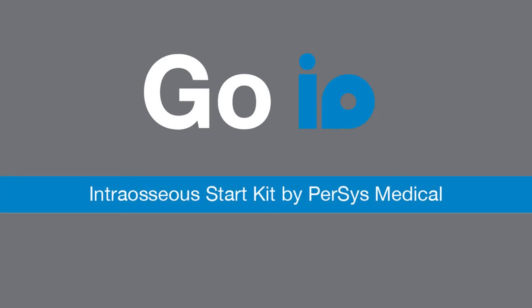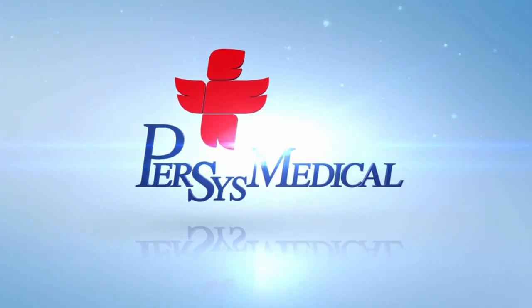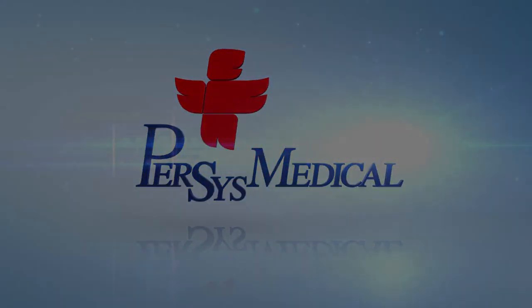Go I.O. Intra-Osseous Start Kit by PerSys Medical.